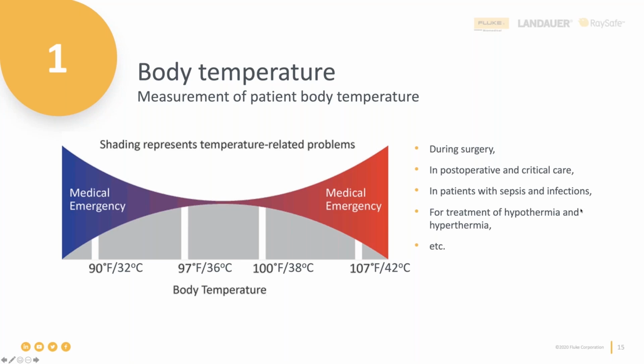What you should be doing is ensuring that the pulse oximeter works for all skin tones, and that's something that functional testers like Spot or Spotlight allow for, because you want to make sure that at every skin tone the device is still within tolerance. So it definitely has an effect.